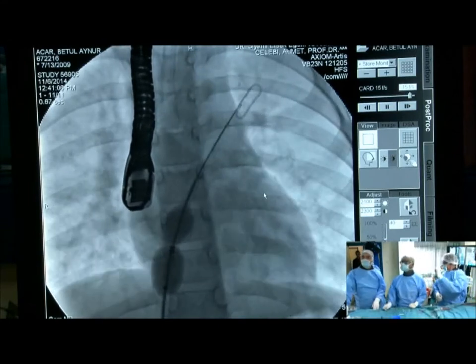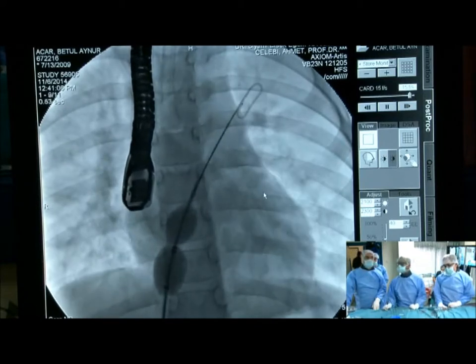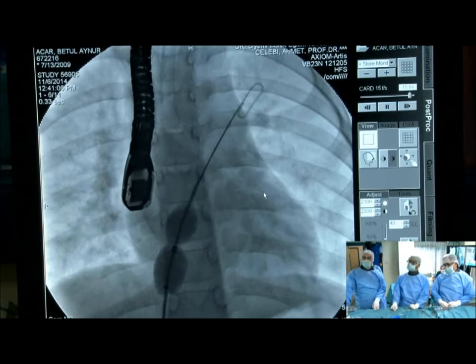Okay, so in the normal method, crossing with a multi-purpose catheter, and then we thought from the TOE that we were through the main defect, but I thought the best thing was to put a sizing balloon in, not for the purpose of sizing, but really to tell us which defect we're through, because we can easily be misled into thinking we're through the main defect, deliver a device, and then it doesn't configure. So the first balloon here shows a very tight constriction, and that confirmed that we were through a smaller defect. Then if we show the next one.